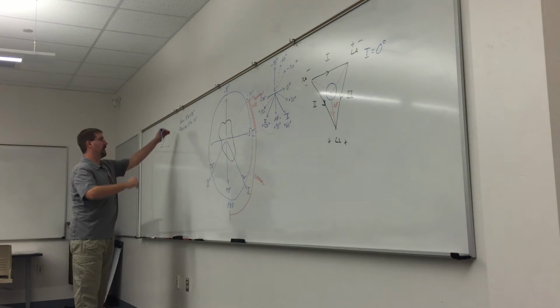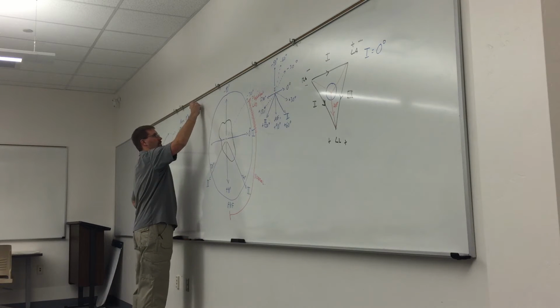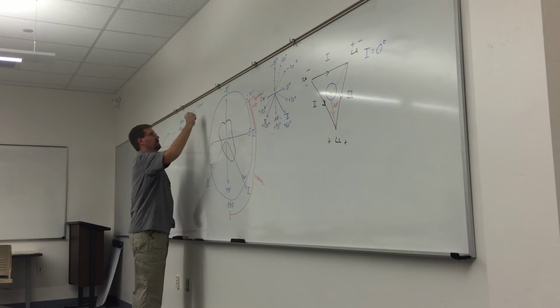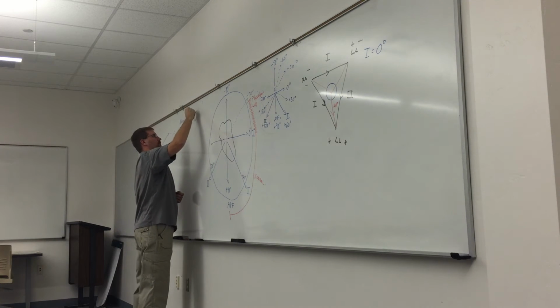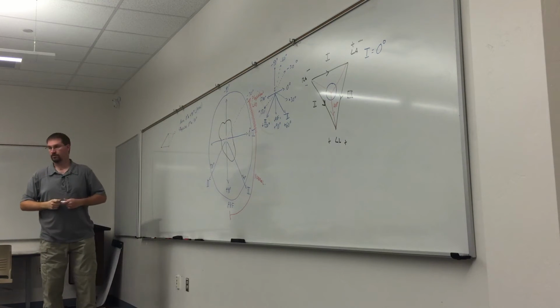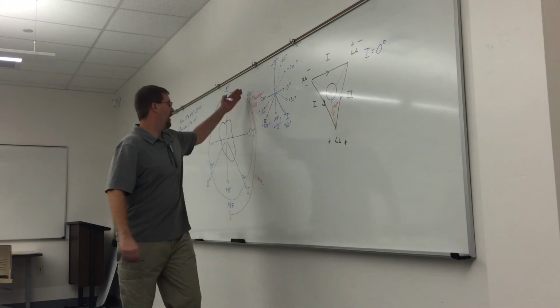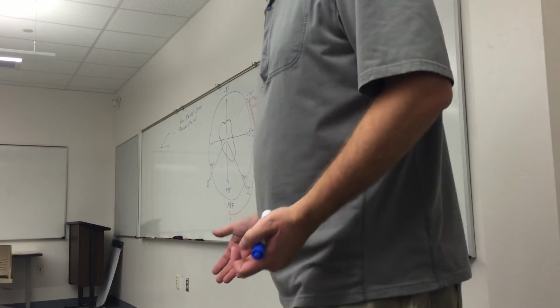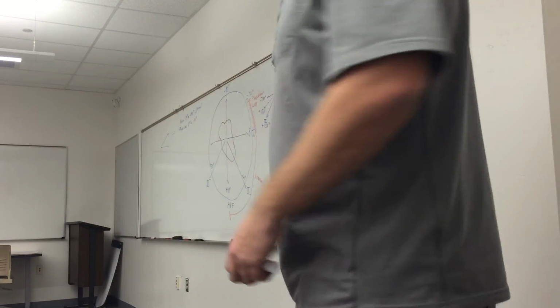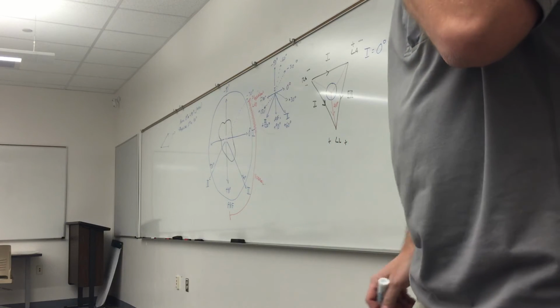So far so good? Okay, so we've got perfect normal, which is 0 to +90. Alright, cool. You guys cool? Tracking so far? Okay, cool. So we've got normal and we've got physiological left axis deviation. So let's now talk about pathological LAD. And where do you suppose pathological LAD is going to be? In the areas we haven't talked about.